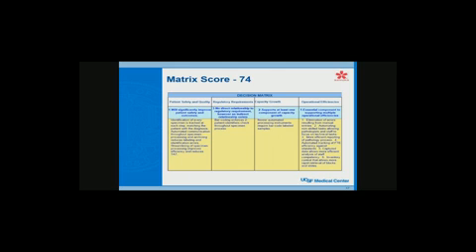Capacity for growth was the next section. And this has to do with, can we handle increased capacity if we spend this money? Our justification was that newer instruments, for instance, immunostainers, can all handle barcoded slides, and their vendors have made it possible to hand off stain orders to those instruments so that you don't have to do any manual programming. And presumably, by reducing time doing that sort of thing, you can spend more time staining slides and push more slides through. So we said we could handle more growth. And actually, it's turned out to be that way, as well as reduced turnaround time.